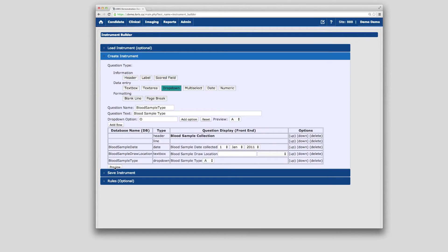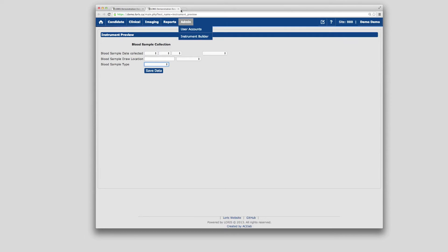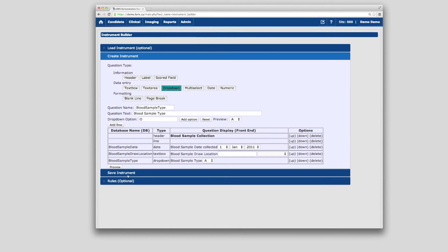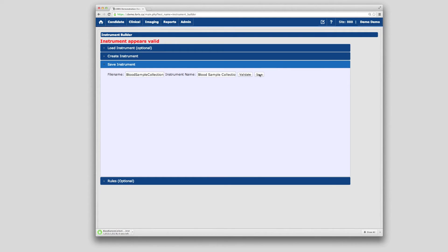Once all fields have been entered, click the Preview button to view the form in a new browser tab. Under the Save Instruments section of the Instrument Builder, enter an instrument name, then validate the form, and finally save the form, which will download a copy to your local computer. From there, the instrument can be added to the LORUS backend through a few quick steps detailed in the LORUS Developer's Guide.